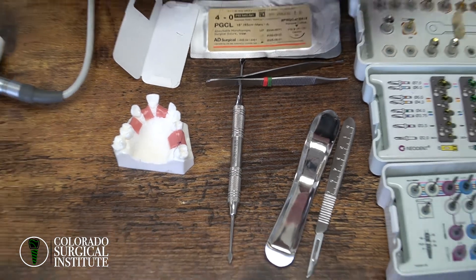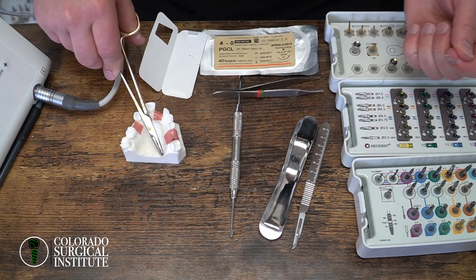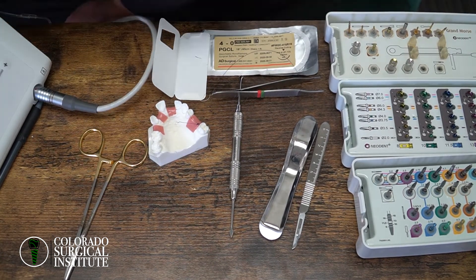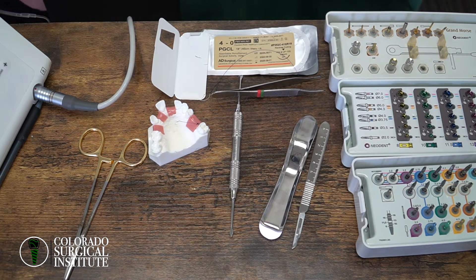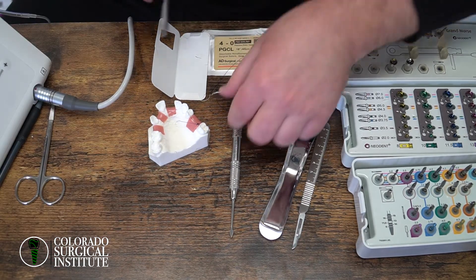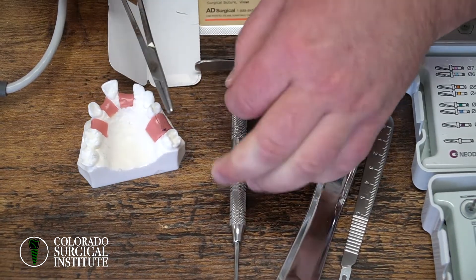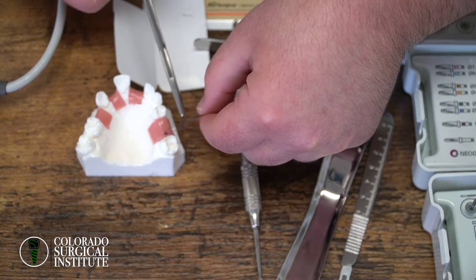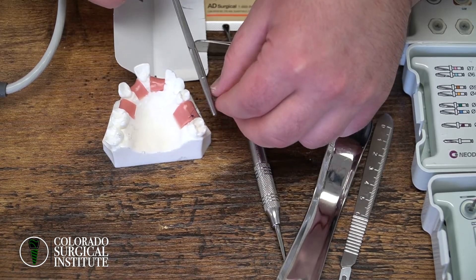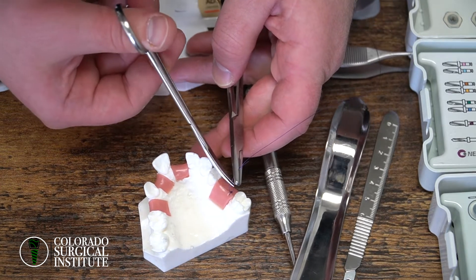Then you go one more forward and one reverse — so I usually go two forward, three, one, one for those. Then I'll pop it. I'll grab both ends with the hemostat for the assistant. I get out of the way and lift it up in the air to make their lives a little bit easier when they clip it.